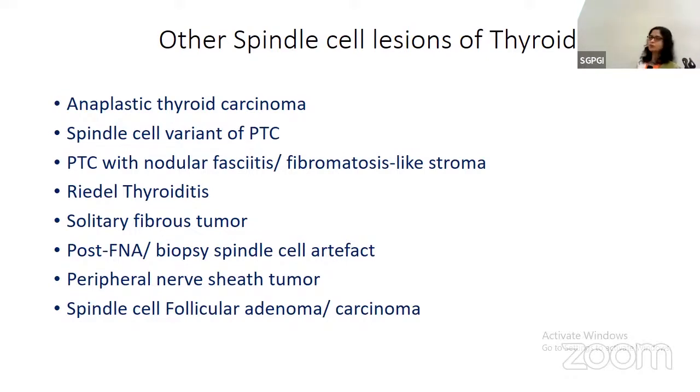MTC, of course, I'm sure none of you will miss it. Spindle cell follicular adenoma and carcinoma, we know that they can occur commonly in thyroid. The rest you also need to keep in mind.